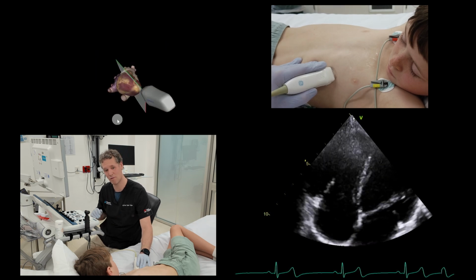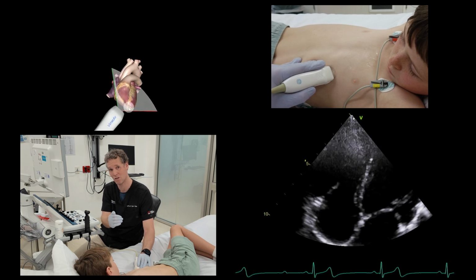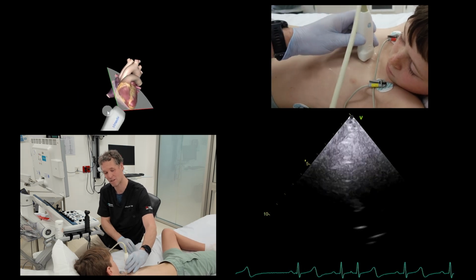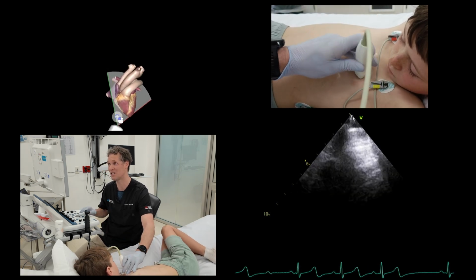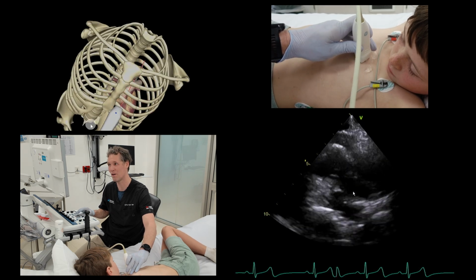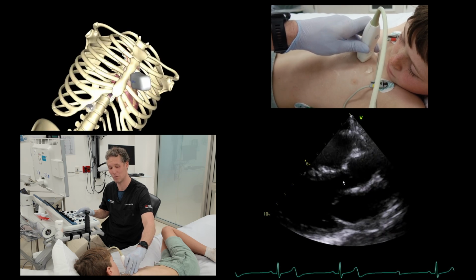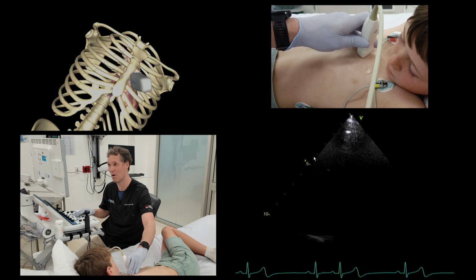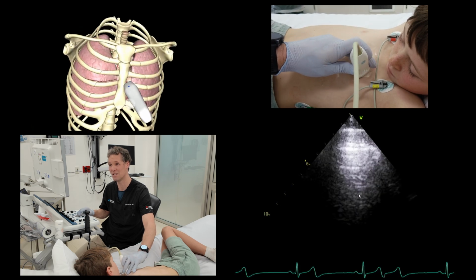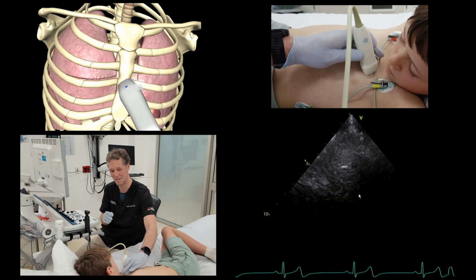And it's really common for us to find that in the apical views we sit too medial, and in our parasternal views we sit too far lateral. So I might just quickly show that if I can. In your parasternal views, if you start to see these dirty shadows like this come in, that's lung. We'll talk about that in a moment. But you want to try and push yourself over till the parasternal structures are more visible. You don't want to go too far as that gets bone where it all looks black. There's the heart. You come too lateral, you get the dirty shadows of the lung. So you're just going to try and find that sort of 20 cents piece that you want to nestle into.